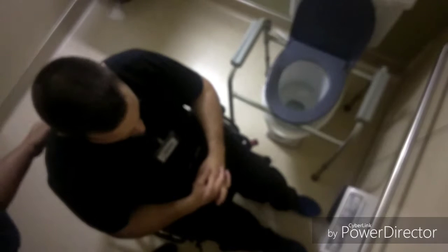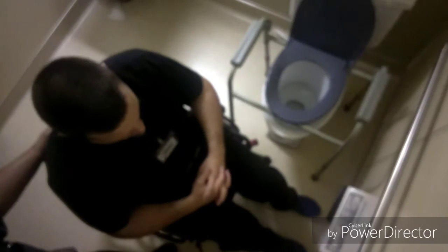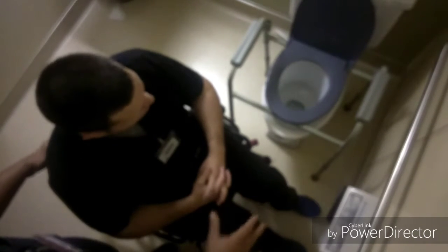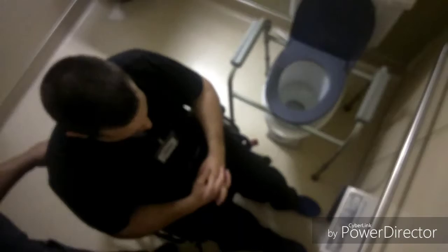So I'm going to be on your side here, and then I want you to reach out for the bar with one hand, and with the other hand, I want you to push up from the wheelchair. So you're going to use both, and then when you stand up, you can put both hands on here, and then I just want you to turn to the toilet, put one hand back, and have a seat, okay? And just for, there we go.